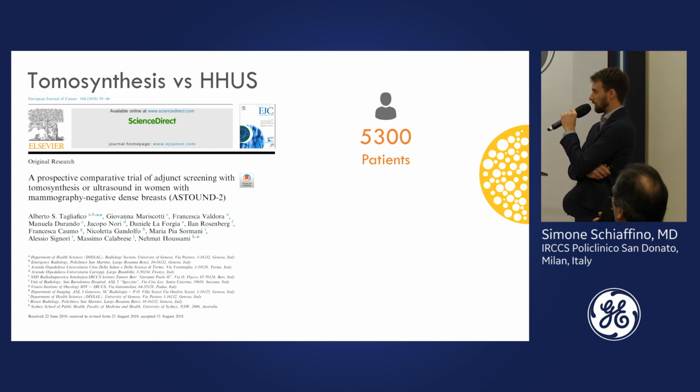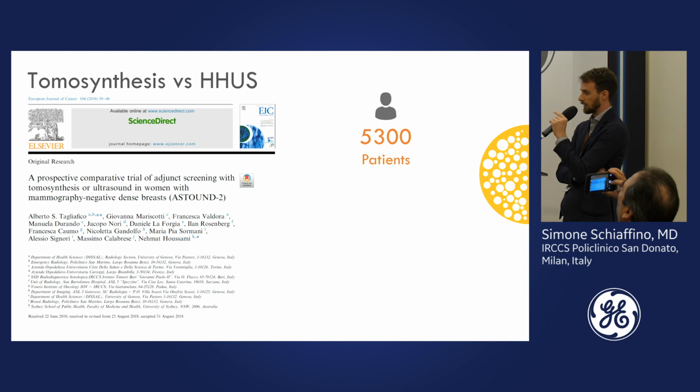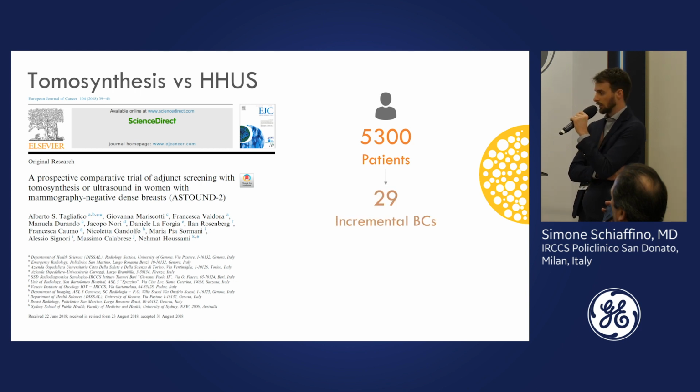They included 5,300 patients, and the adjunct of digital breast tomosynthesis and ultrasound found 29 incremental breast cancers. 12 of these were seen both by digital breast tomosynthesis and ultrasound, 3 only by tomosynthesis, and 14 were only detected by ultrasound.